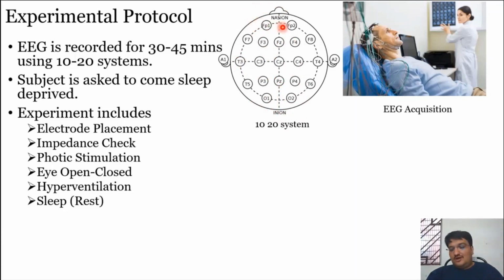Also, you should know which are the lobes: frontal, central, temporal, parietal, occipital. Some epilepsies are specific to a particular lobe. In the US there are very many cases of TLE, that's called temporal lobe epilepsy. Mostly the seizure would be focused around T3, T5 or T4, T6. So it is important to know all the nomenclature and why people are using the 10-20 system.